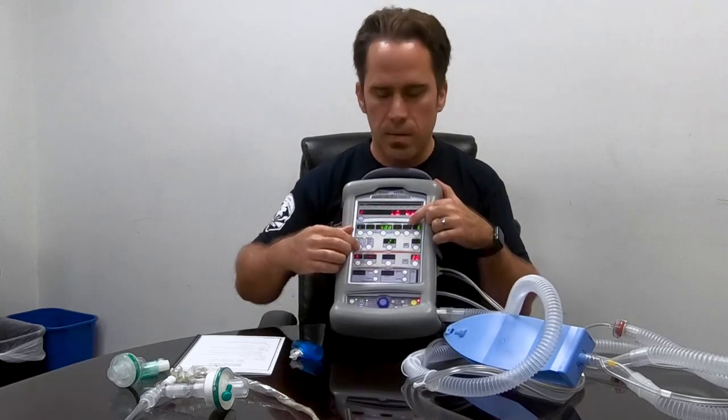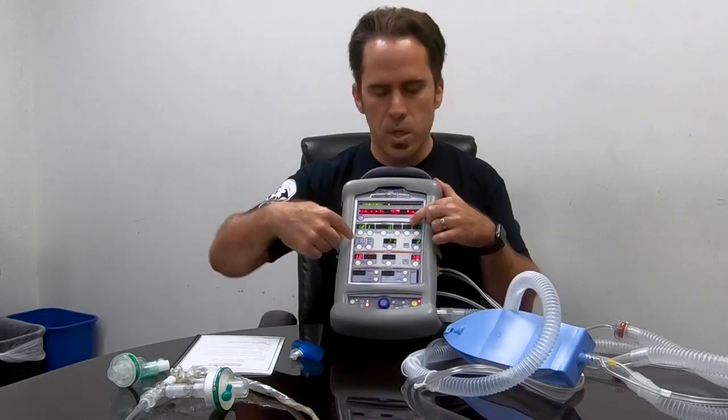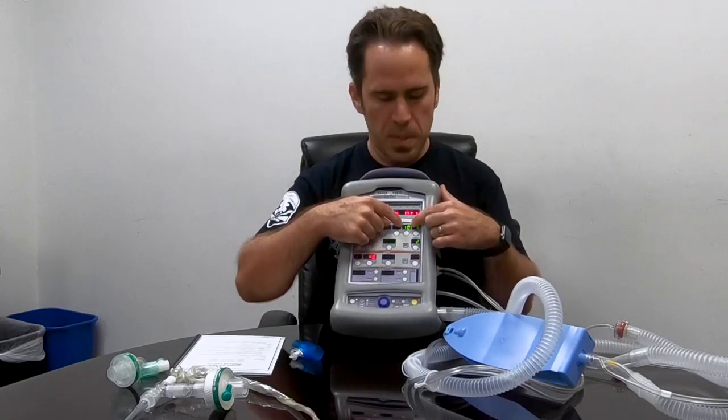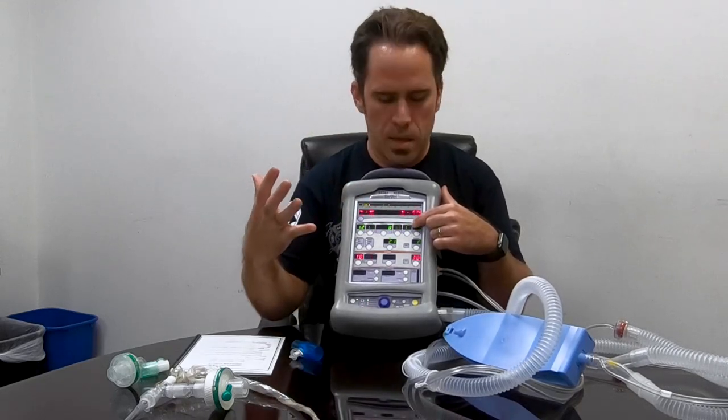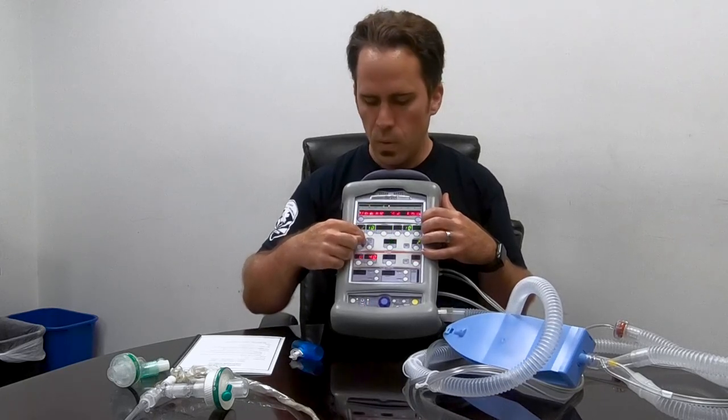Next, I take the breath mode and bring it down to SIMV — we're in assist control and I bring it down to SIMV. I click it, it starts blinking, I move it, then double check and click it again. Now I'm in SIMV. The only thing that changes is a pressure support breath pops up. The difference between assist control and SIMV is this pressure support: if the patient takes their own small breath, the machine gives them a little help, which is more comfortable than AC giving them a full machine breath.